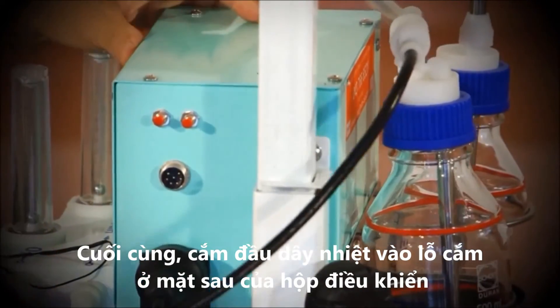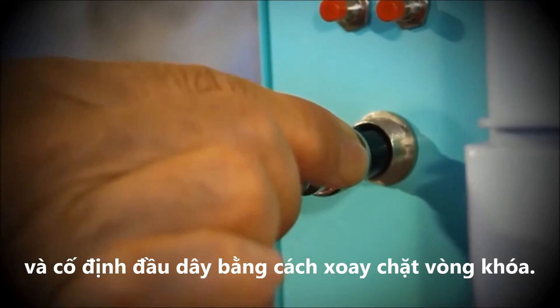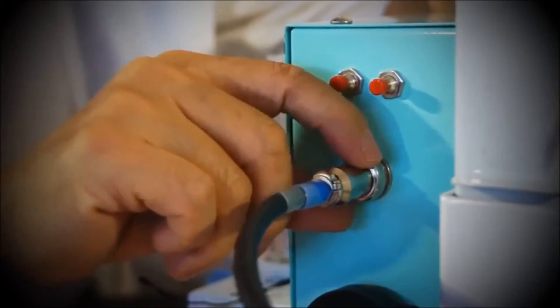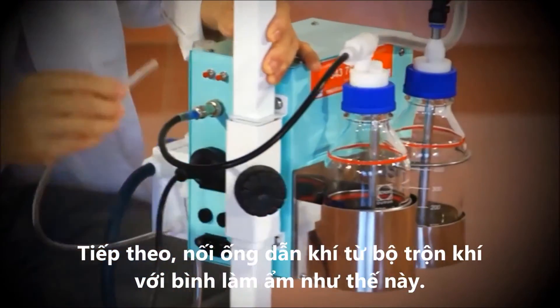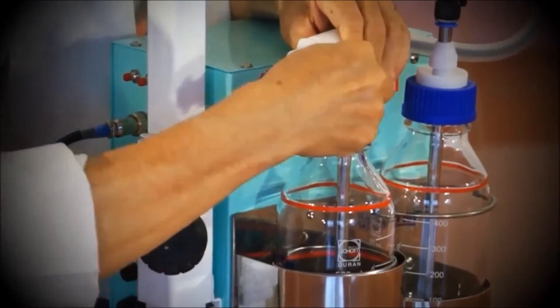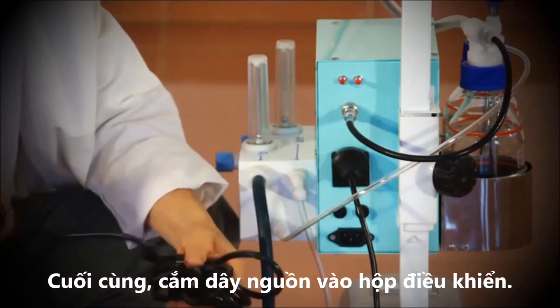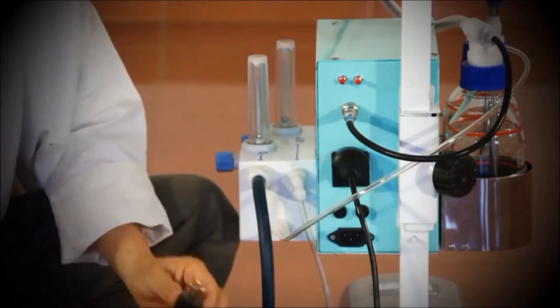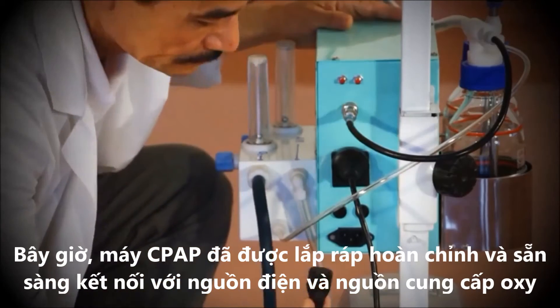Finally, connect the heater wire to the back of the control box and secure it by tightening the connector ring. Next, connect the gas supply tube from the blender to the humidifier bottle. Finally, connect the power cord to the control box. The CPAP is now ready to be connected to the power and oxygen sources.